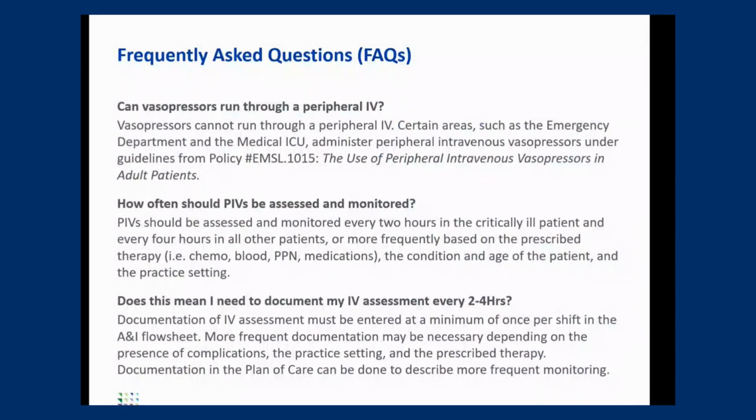Patients can't be discharged home with arrows. They can be discharged home with midlines if it's deemed appropriate, but the arrows have to come out just like a regular peripheral.